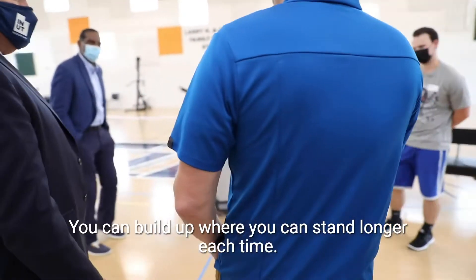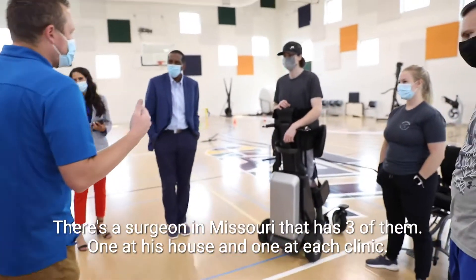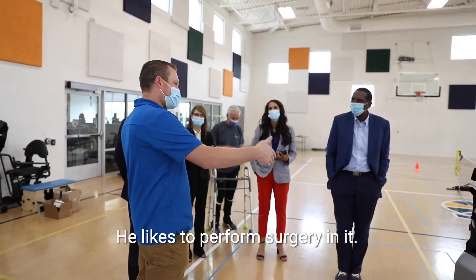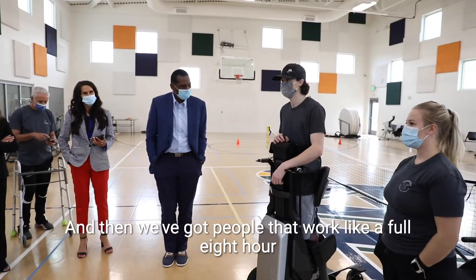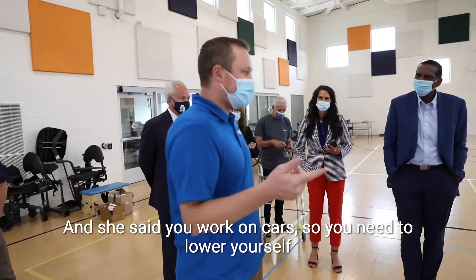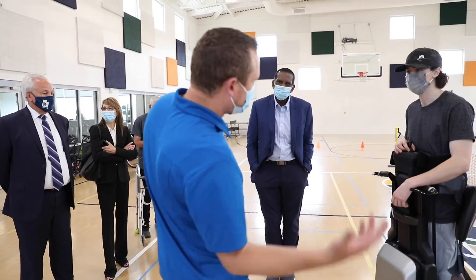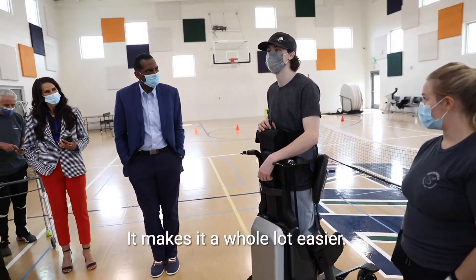That's one of the nice things — you can build up to where you can work full shifts. We have a surgeon in Missouri who has three of them: one at his house and one at each office. They'll actually perform surgery in it. And we've got people who'll work a full eight-hour shift in the device. If you work on cars and need to lower yourself down to reach something, you can do that.